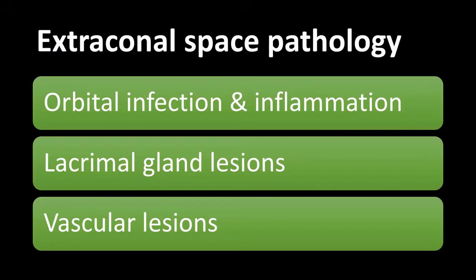When it comes to extraconal space pathology, the spectrum of lesions you can encounter in that space is actually quite diverse, but a lot of these are also very infrequent. So I was a bit selective and I'm going to show you especially orbital infection and inflammation. I'm going to talk briefly about lacrimal gland lesions, but I'm not showing you many cases because I don't have that many.